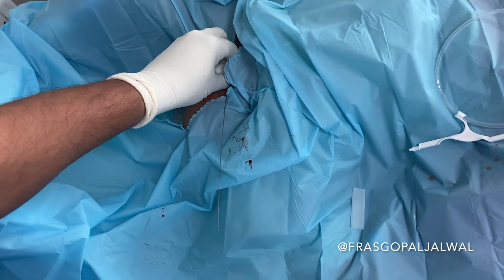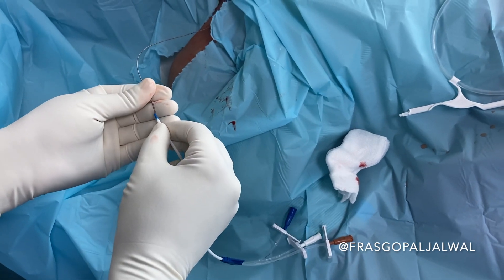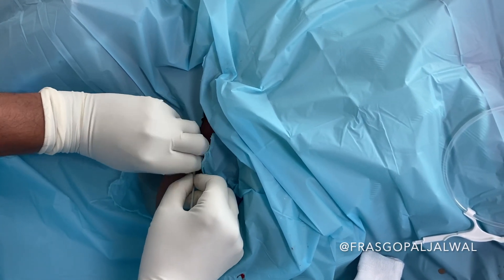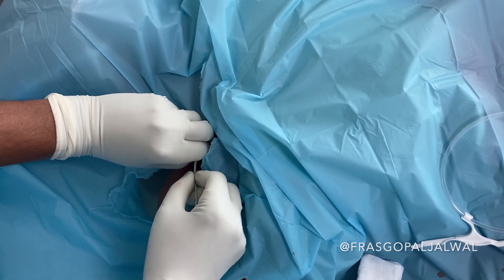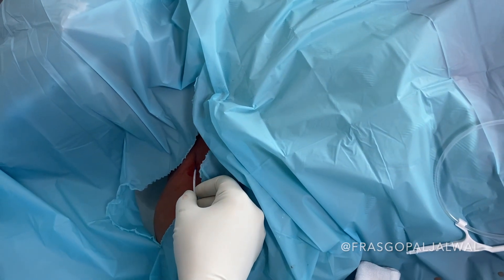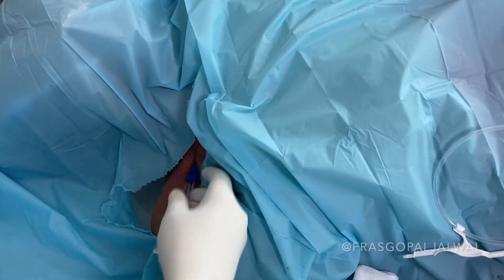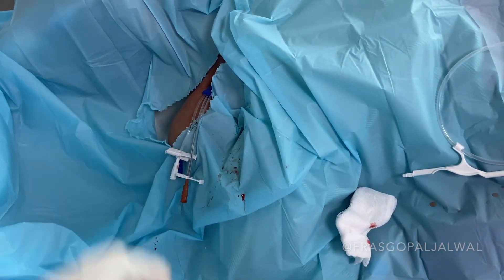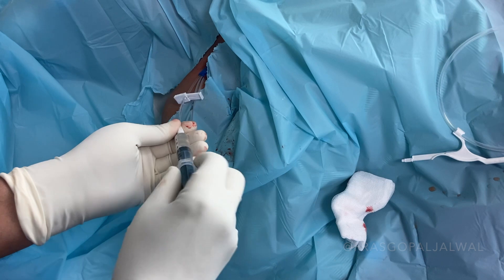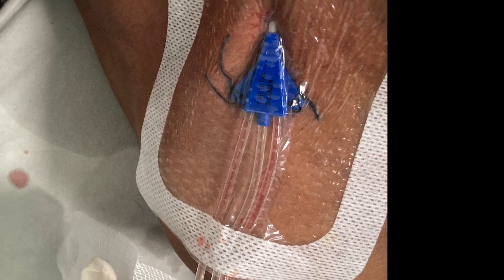Remove the dilator and then railroad the CVP line over the guide wire. When you see the guide wire appearing at the other end of the CVP line, hold the guide wire and push the CVP line over it. Then remove the guide wire after confirming free flow of blood from all ports.